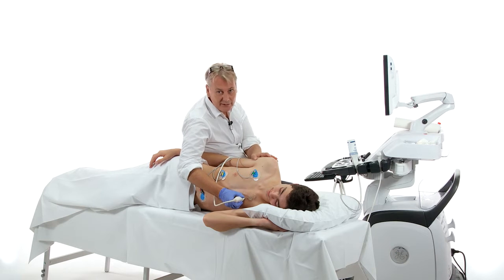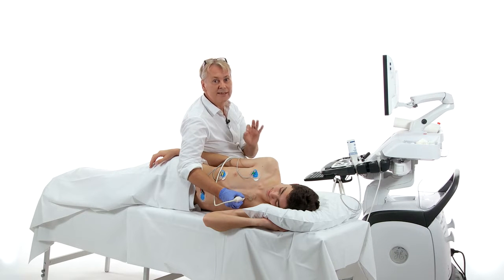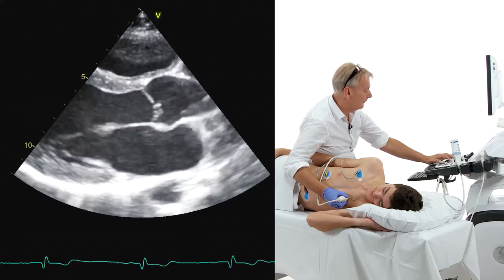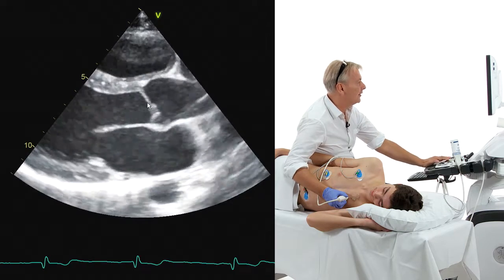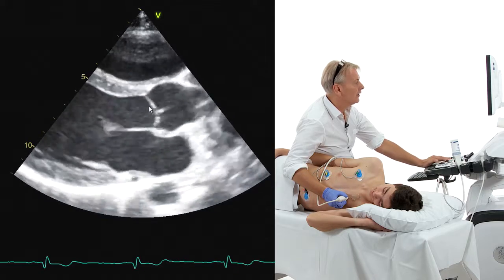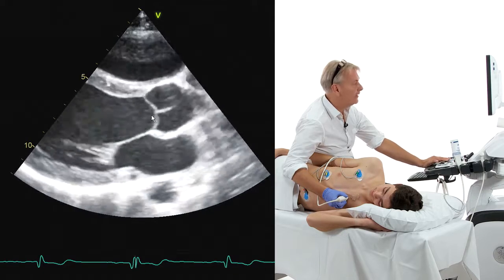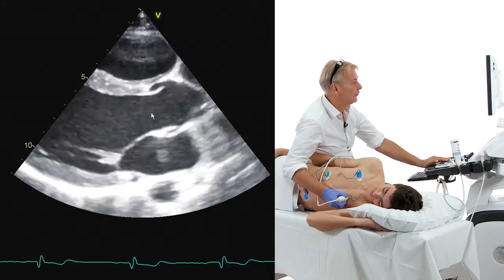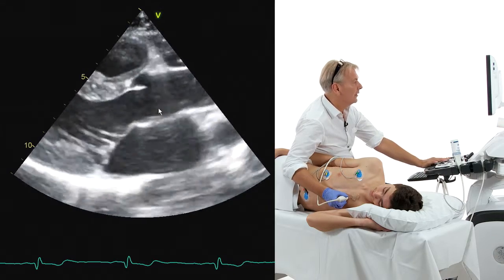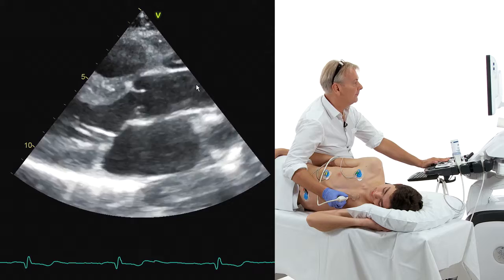Now, the image quality here is really superb, so you can see even very detailed and small structures. What do we have here? Well, we have the aortic valve. This is the right coronary cusp, and this could be either the acoronary or the left coronary cusp. It depends very much on how we angulate the transducer. We have the ascending aorta here.